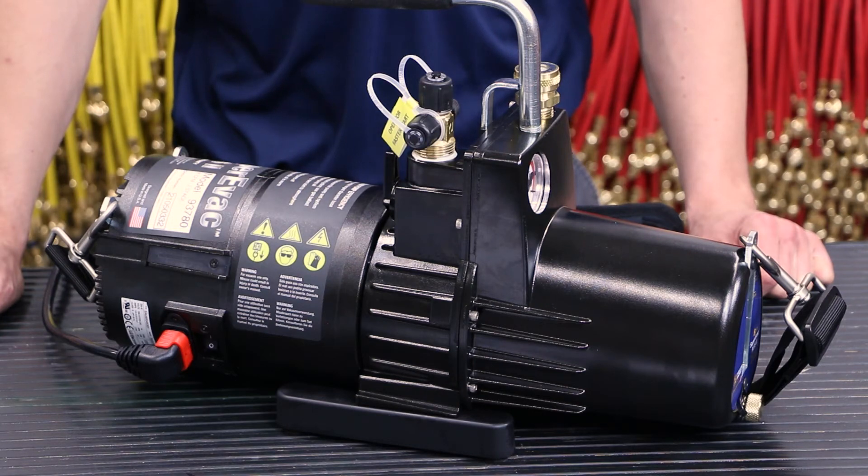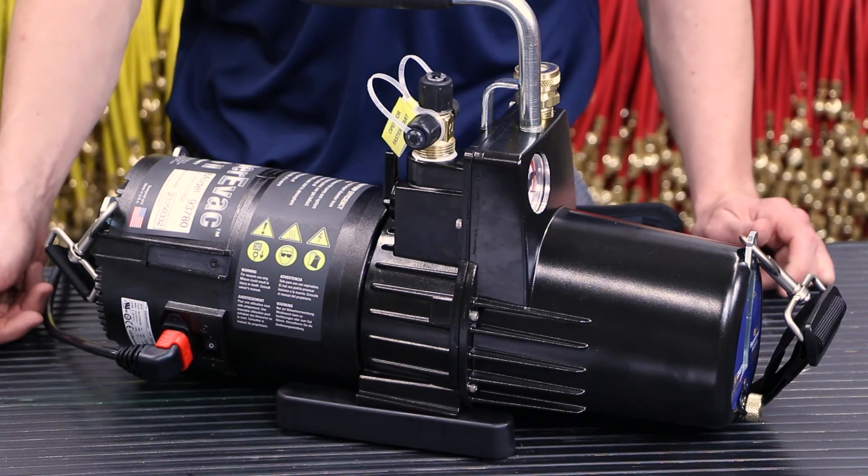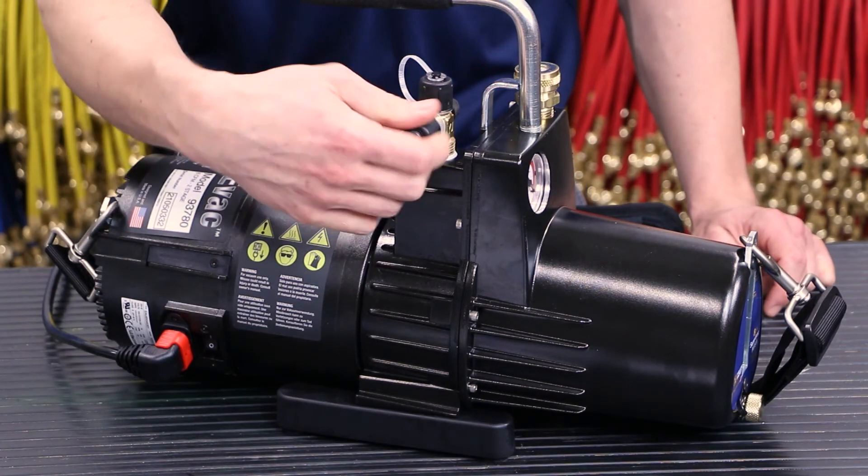If you let the pump continue to cycle, it will start in less than five minutes. If you want to speed up the start, simply open the intake fitting and vent it to atmosphere.